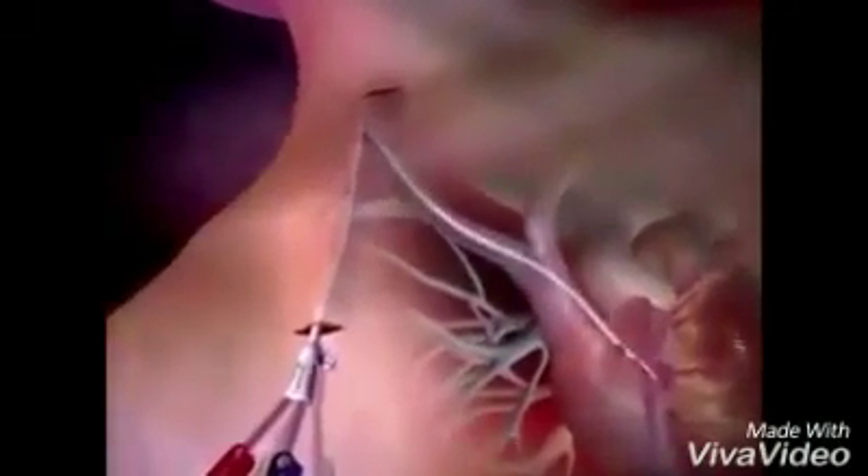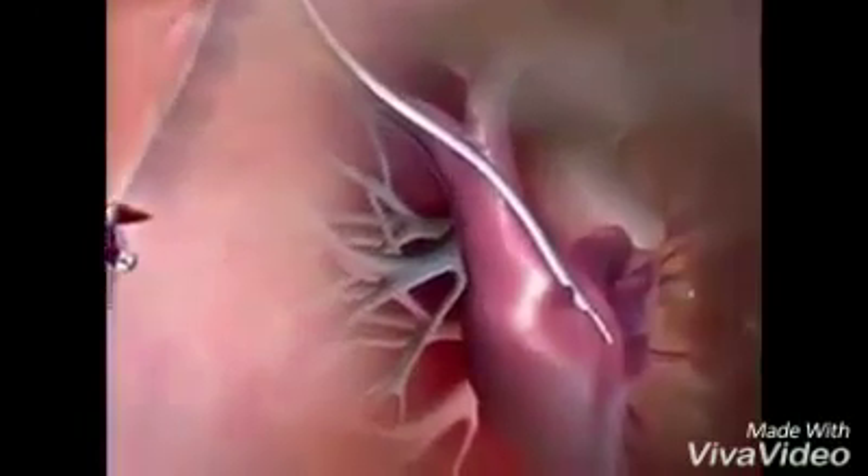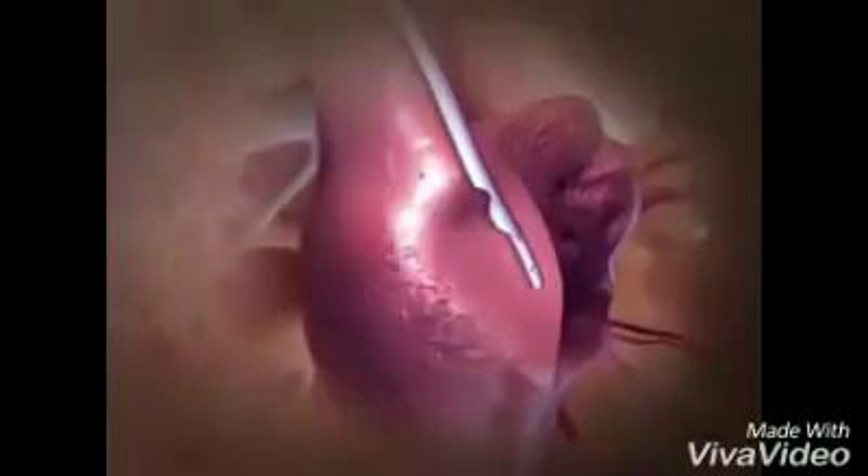Confirm proper tip placement with fluoroscopy. Suture to secure the catheter hub to the chest wall. The unique design of ProGuide, specifically the apposition deflection feature, or bump, reduces the risk of it lying directly against the vessel wall or wall of the heart. The benefit is that it provides smooth, uninterrupted flow of blood through the catheter.